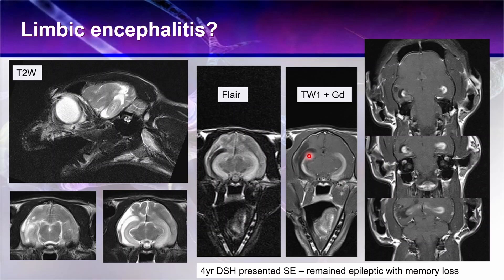We have contrast enhancement of the mesotemporal lobes that is really quite dramatic. We also have leptomeningeal contrast enhancement, which is much more pronounced on this side compared to the more normal side. Of course, the meninges will enhance with a little bit of contrast because they don't have a blood-brain barrier. We definitely have an active ongoing inflammatory process that involves bilaterally the limbic area — it is limbic encephalitis in that respect — but it does also appear to involve the cortex.